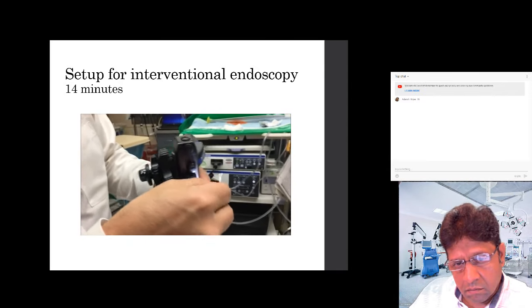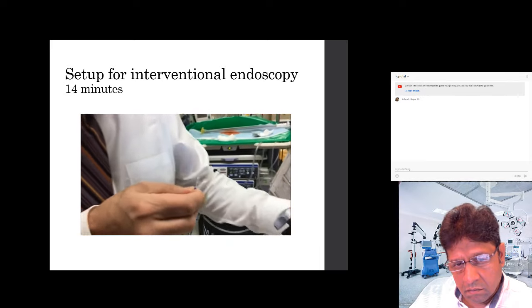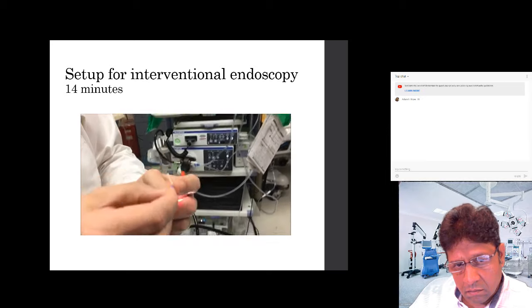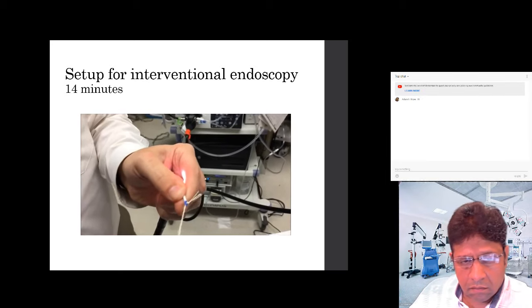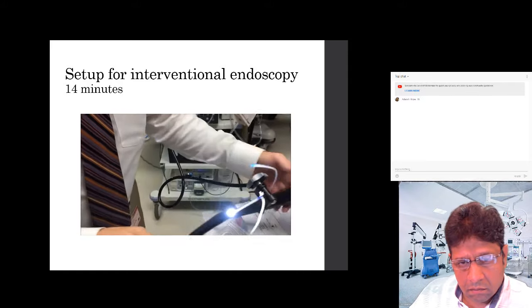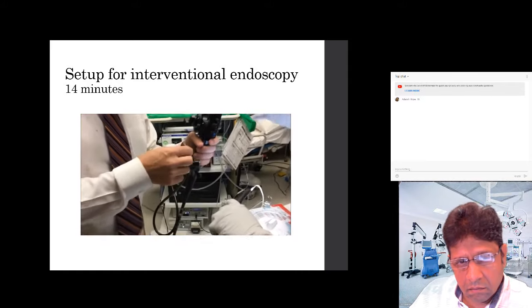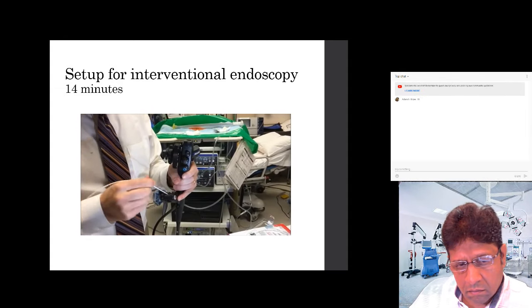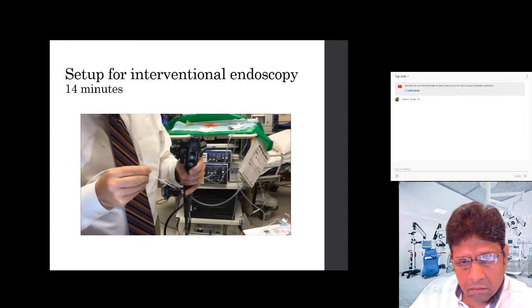And this basically hooks. Actually, I'm going to pass the scope over to you now, if that's okay. We take this little knot, and it just goes into that little hook there. See that? Yeah, exactly. It just stays in. And then now I'm going to switch with you. Now we pull it out, okay? So I'm going to drag the whole thing out through.